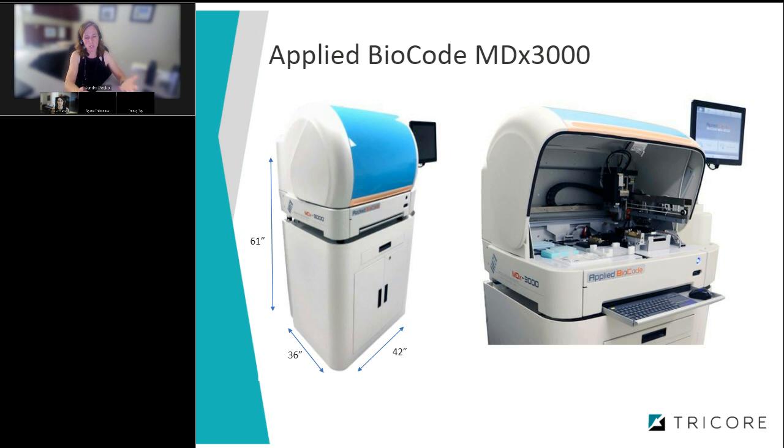If you contaminate your gloves, obviously changing those out, right? So there are aspects of setting up a full plate that make it much more difficult than just 12 or 15 samples at a time. And it is more time consuming. So I would say it would take around 45 minutes to set up versus 10 or 15 minutes for a smaller batch.